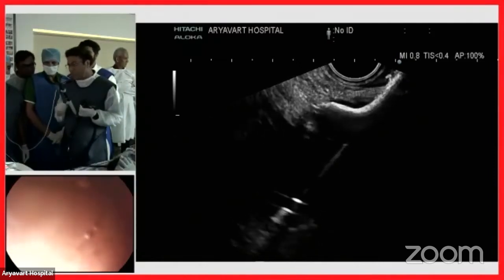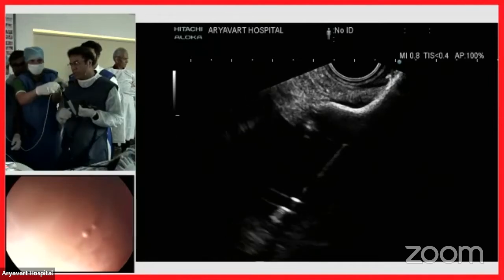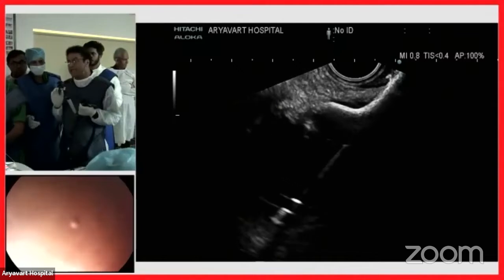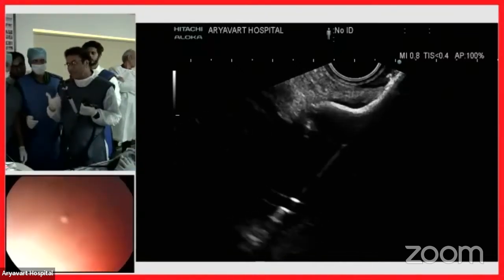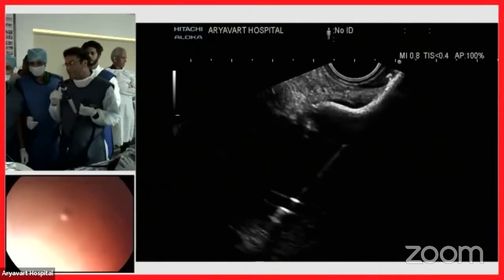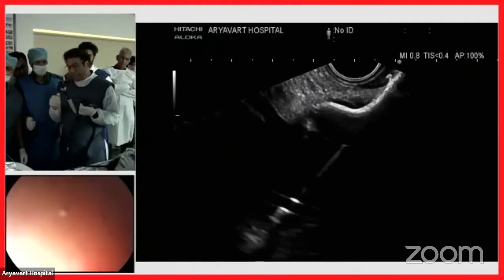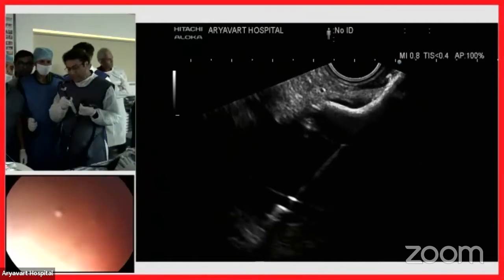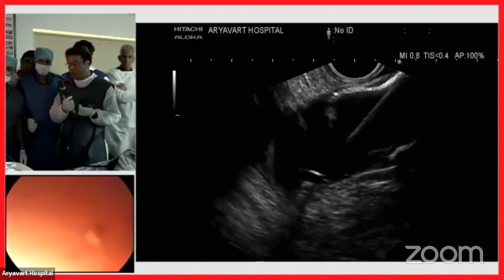For the third step, we need to position this distal flange. You can just unlock this. The issue is this stent is just a 1 centimeter stent, and you have to ensure that the stomach as well as the small bowel loop are very close together. So now we have deployed and opened up the distal flange. Now I'll try to position it right. I will unlock this again, push this up, push this up, push this up.